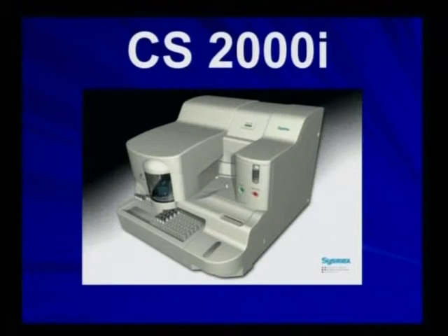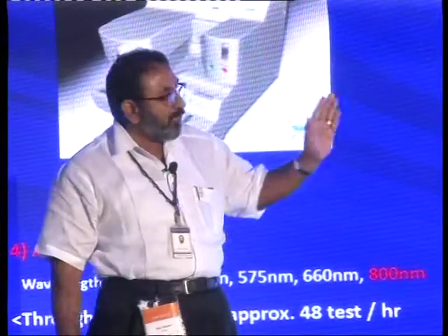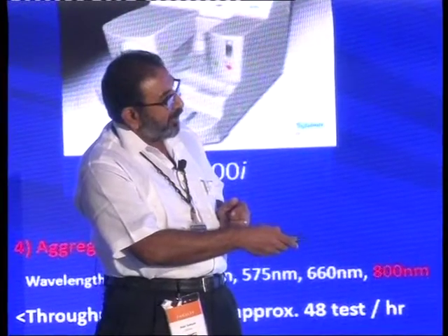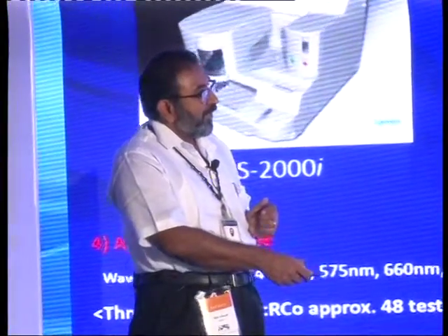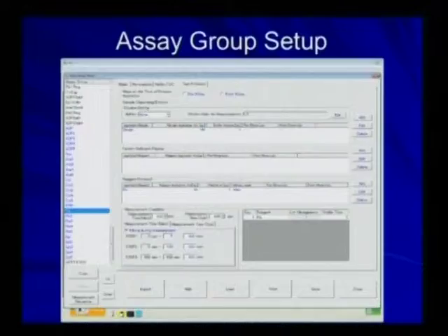And that's because I have been having this instrument in my lab, last year I took a session in which I showed you that I'm doing a fully automated ristocetin cofactor assay using this because it has an aggregometry cuvette position. So 3 days back, that is on Wednesday, Sysmex Japan gave me this software where they developed an aggregometer or platelet mode on my coagulometer, and I loaded this test. You see the sample volume is 140 microliters and the reagent agonist volume is only 20 microliters. And these are the various settings for that, and that's the calculation method.